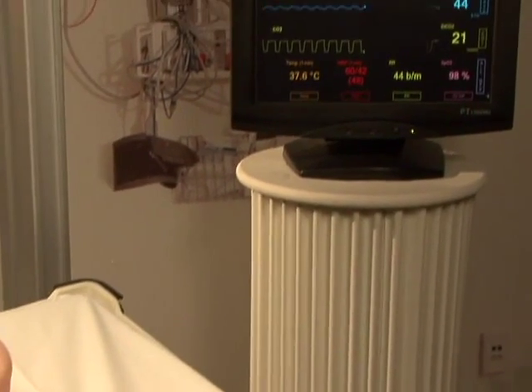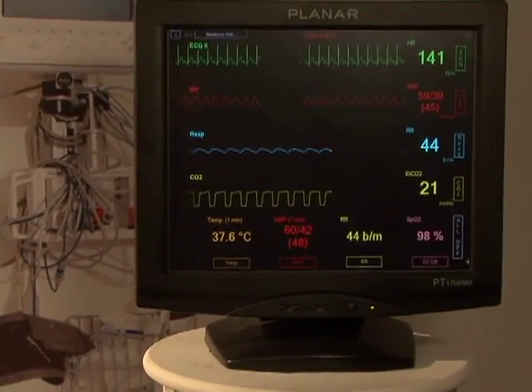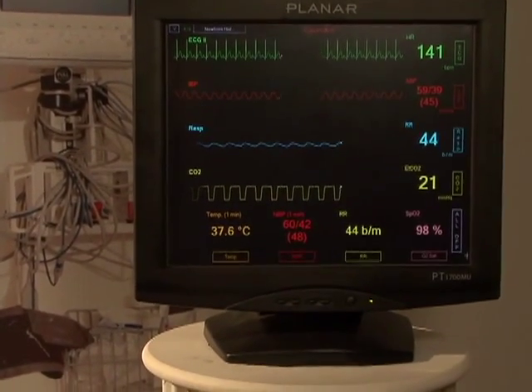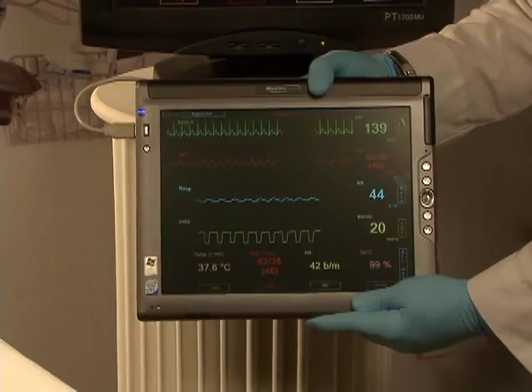For additional realism, virtual vital sign monitors are available in both fixed and mobile formats.